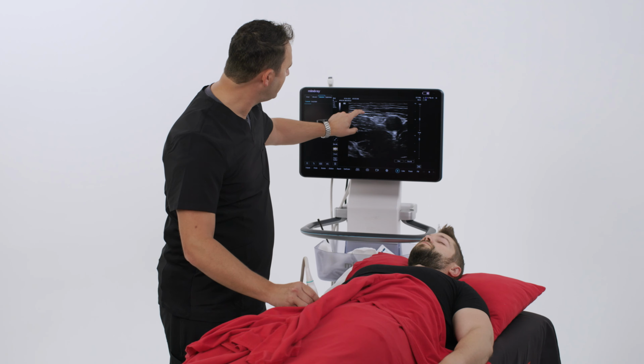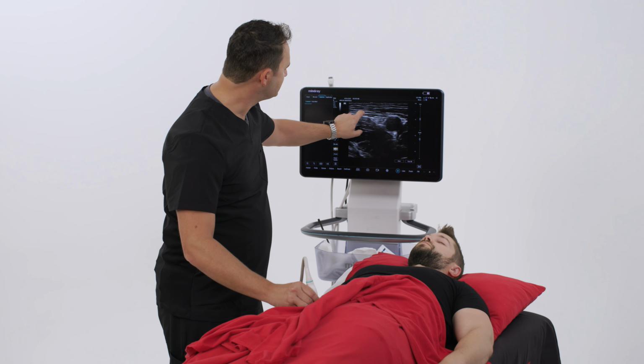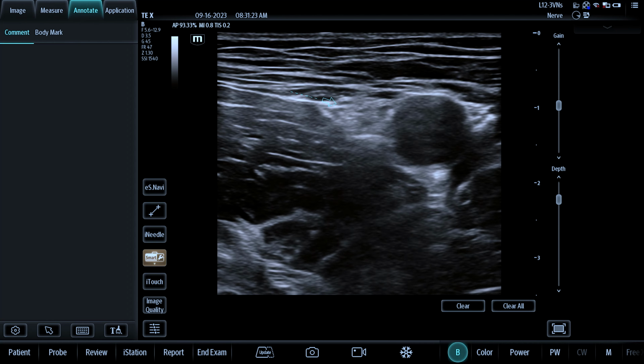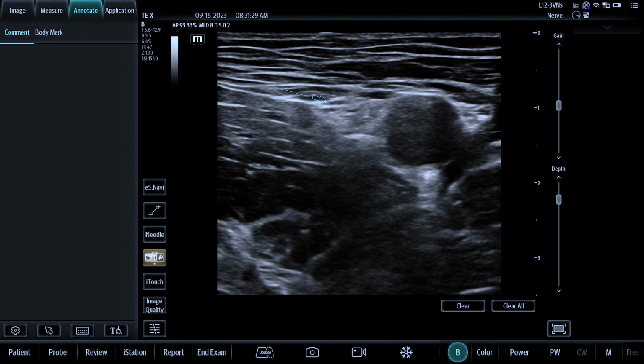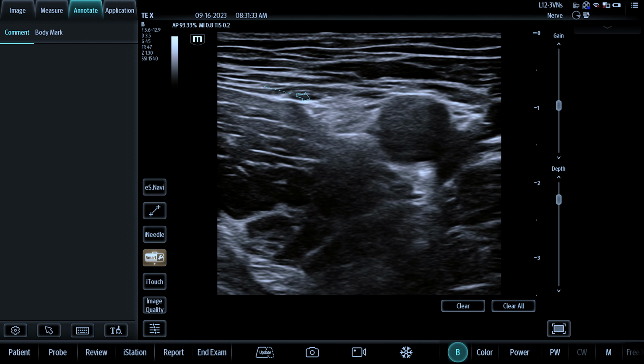You can certainly come and attack the nerve on top of it this way, but the problem with that is a lot of times when you put your needle above the femoral nerve, it's hard to pierce the fascia iliaca, which is here. It's a very fibrous fascia, and if you put your local anesthetic above the fascia iliaca, the femoral nerve block is not going to work or last as long.